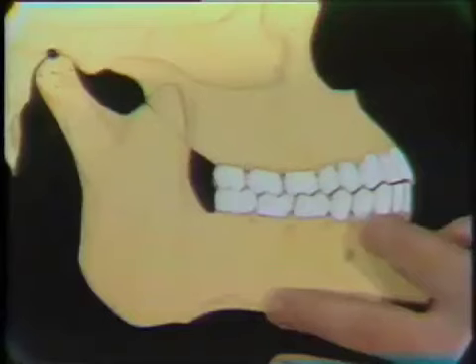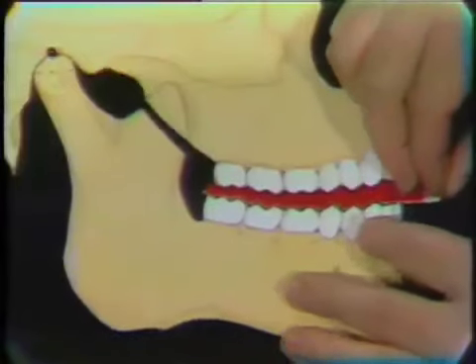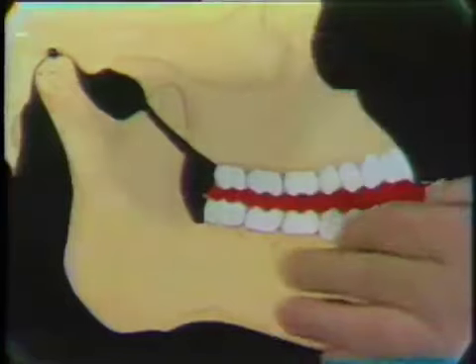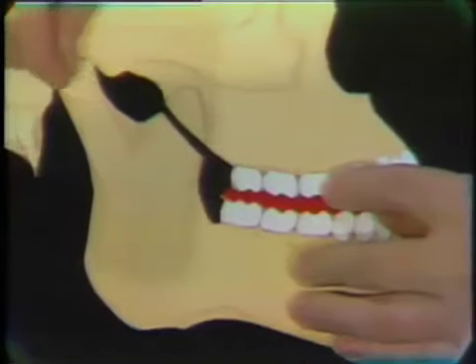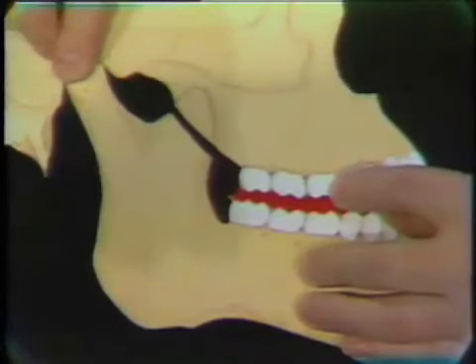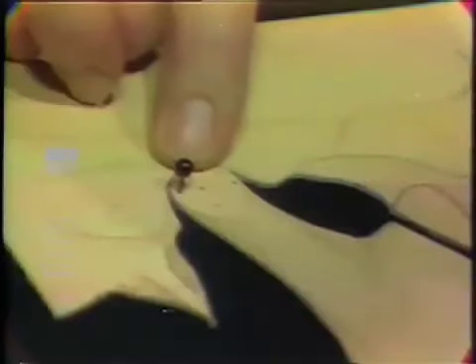Okay, let's take the centric relation registration again, and we have it mounted on the articulator, the lower cast mounted to the upper cast. And this time we have erred, and we have an arbitrary axis that is behind or posterior to our true hinge axis.